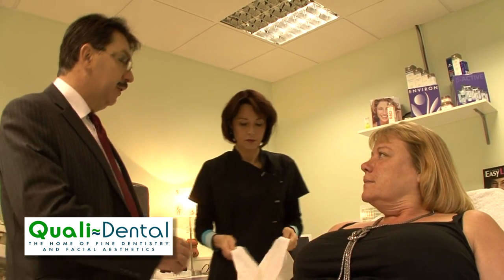Yeah, coming along nicely. I think with all the treatments that should be really nice. We should get a really good result. Fantastic. Right now, Nicola's going to get you ready. She's going to put some Emla cream on you to get it all nice and numb.